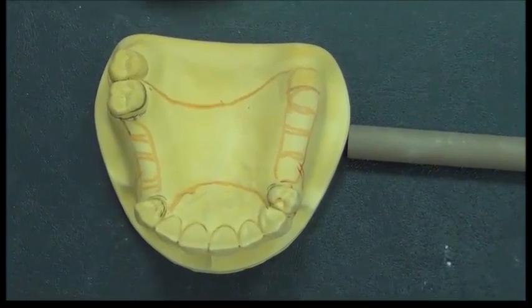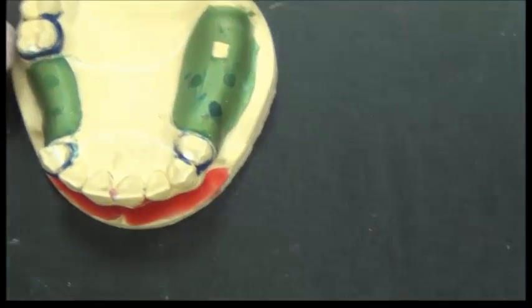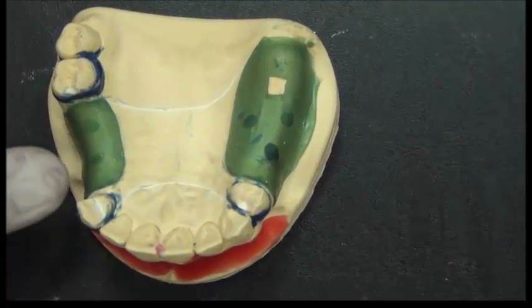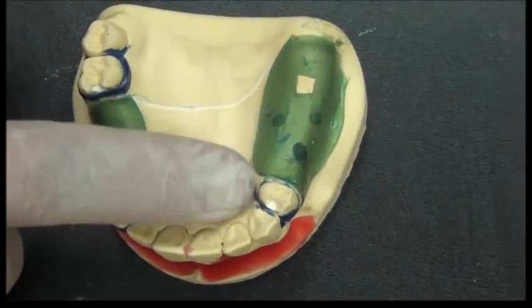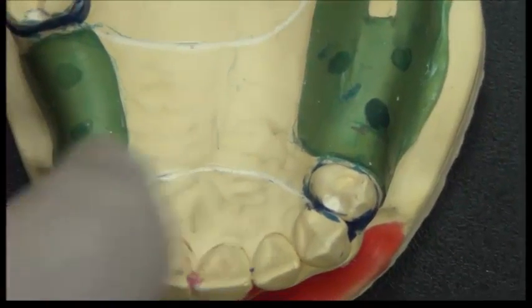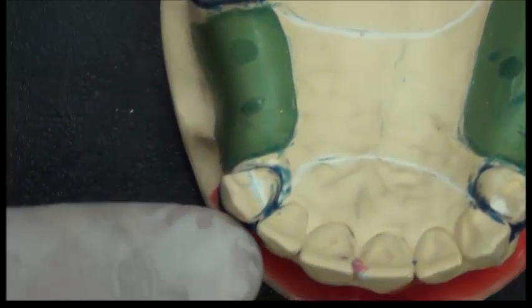Later, this cast itself is going to have multiple areas of blockout. You can see that there are multiple areas where wax is added in a planned way. This is the gauged blockout. This is an arbitrary blockout on the embrasure. We will have parallel blockout, and we will have what we call shaped blockout.